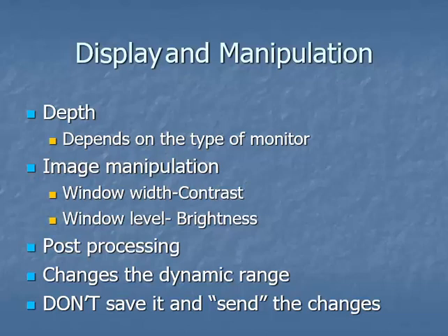In addition, your image matrix is going to be a lot smaller, or the pixels are going to be a lot larger. So keep in mind that whatever you see on your image display in the light room, at the workstation, or in the patient's room in the X-ray room, is not going to be the same as what the radiologist sees.